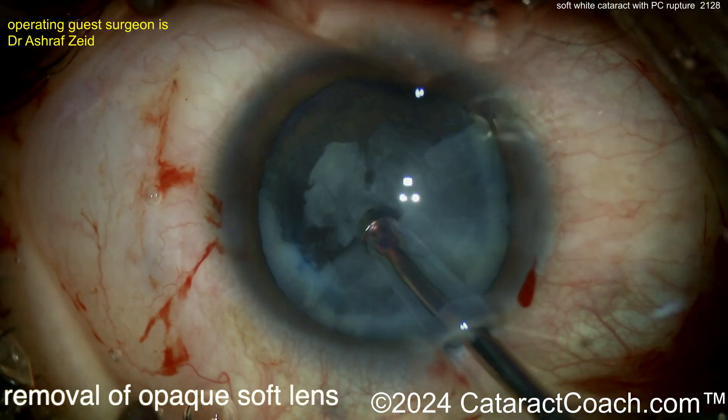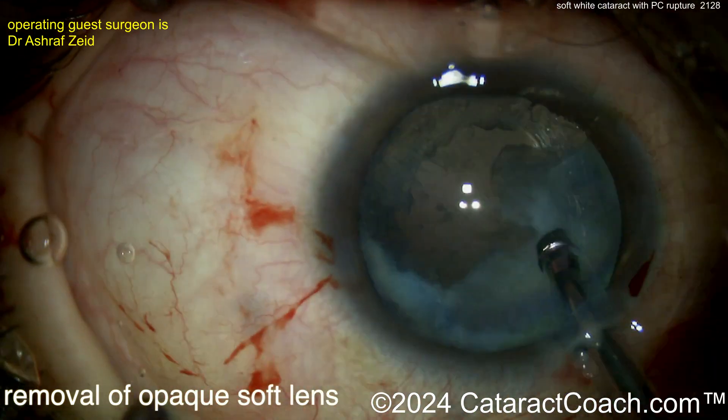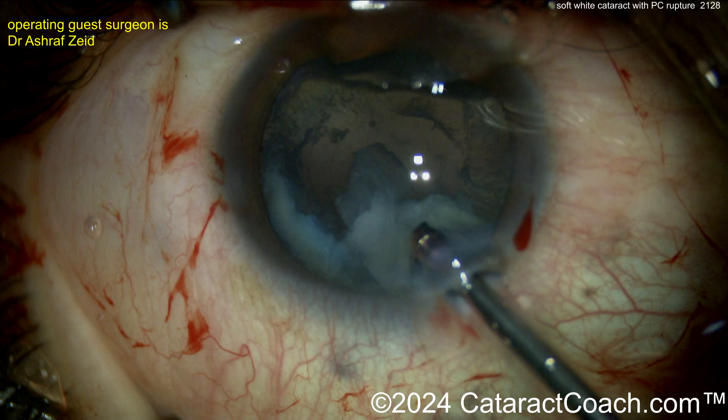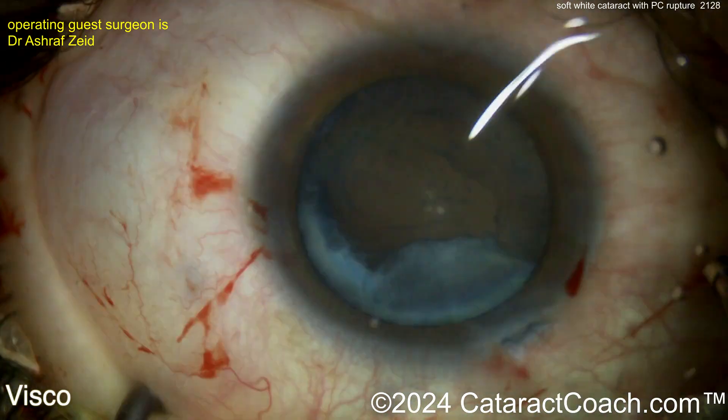Trying to get these pieces up — you don't want too much manipulation, because you don't want that hole in the capsule to become even larger. Watch carefully as you perform this to ensure that no pieces are falling back into the vitreous cavity. If they do, you need to get those out. You can see the posterior capsule is certainly open.